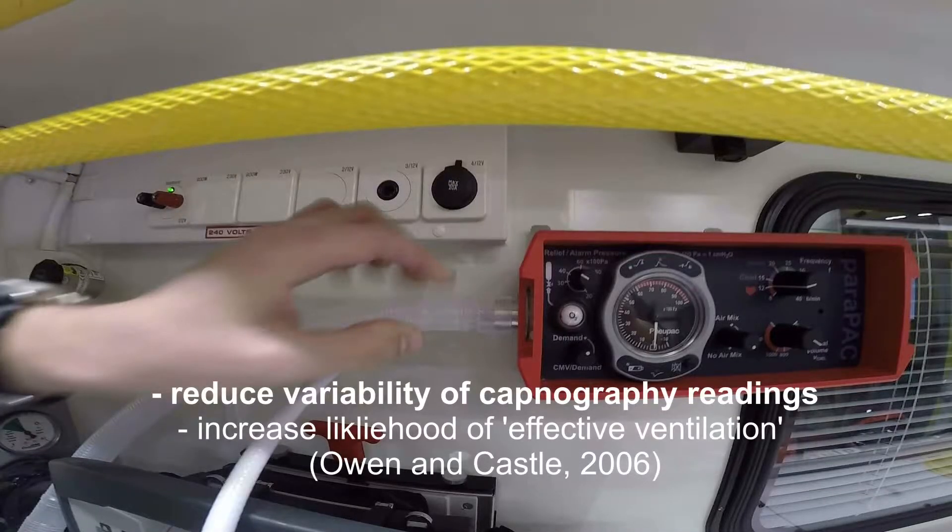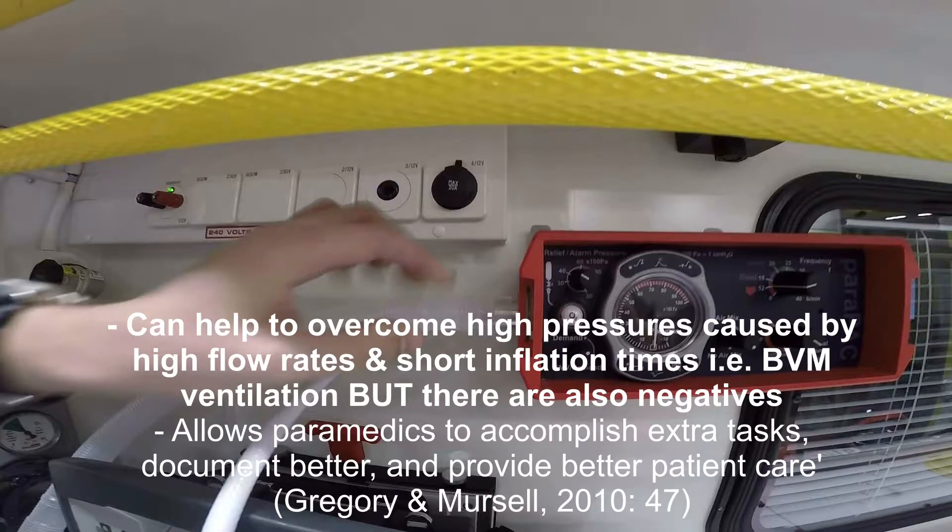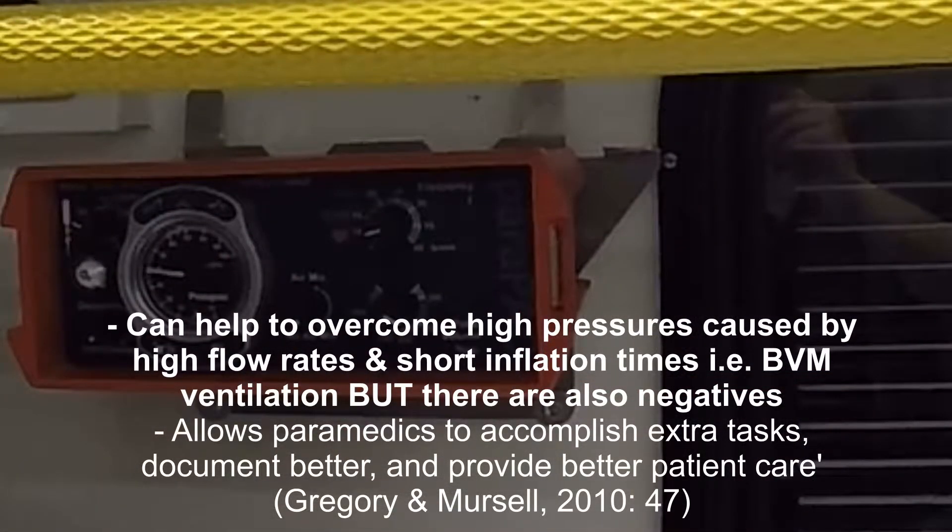Research suggests that mechanical ventilators can reduce the variability of breath timings and, as a result, capnography readings. They can also increase the likelihood of effective ventilation. To quote from Gregory and Mersall: a high flow rate over a short inflation time inevitably produces a high peak airway pressure in an unprotected airway. High peak airway pressure overcomes the pressure of the lower oesophageal sphincter and causes gastric inflation. Use of a mechanical ventilator may help to overcome the high pressures involved.